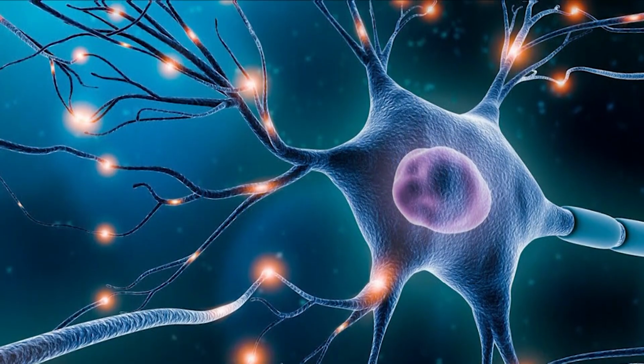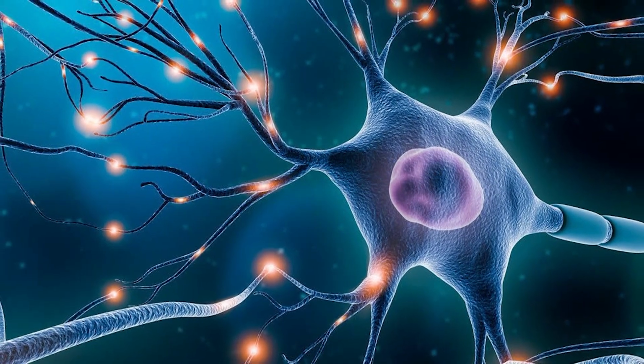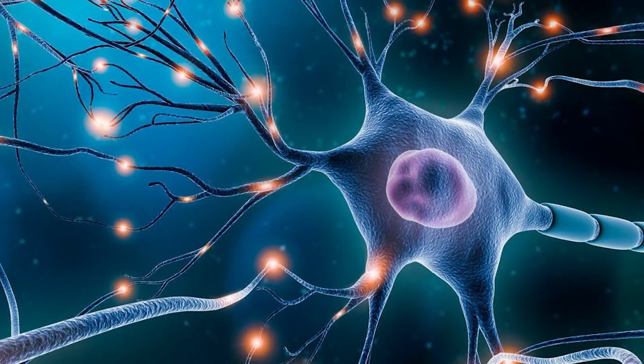In summary, EEG is based on the principle of detecting and recording the electrical signals generated by neurons during their communication. Through the strategic placement of electrodes on the scalp and amplification of the signal, EEG provides valuable insights into brain function, cognitive processes and neurological disorders. Through careful consideration of challenges, accurate interpretation is crucial for meaningful analysis.